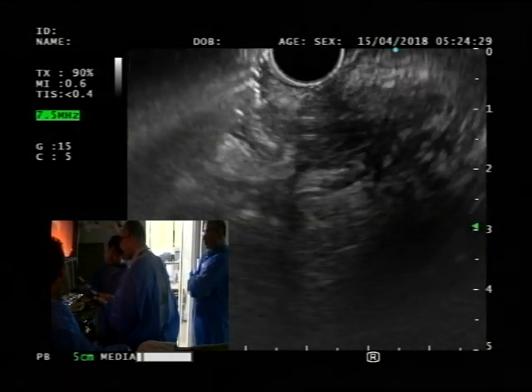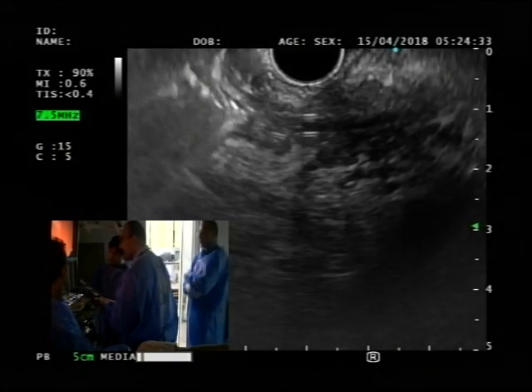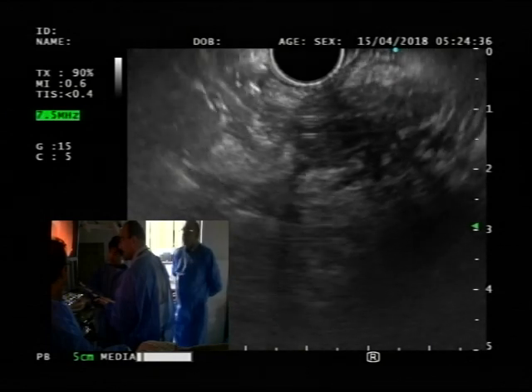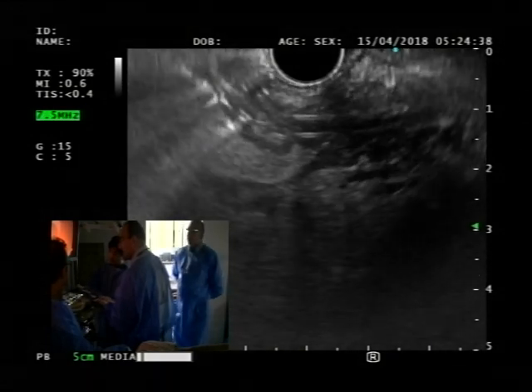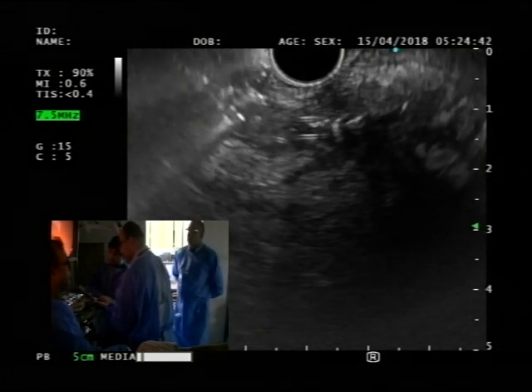This time I might go right across the stent. Right, which is fine. I mean, that's not a big deal, but I'm having a hard time seeing my needle right now, but I can maybe make out the indentation a bit.